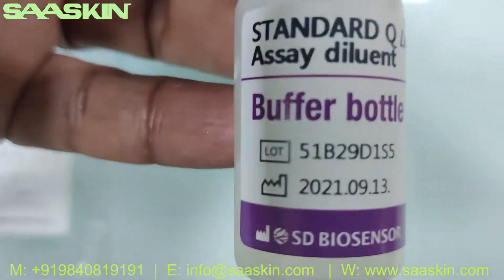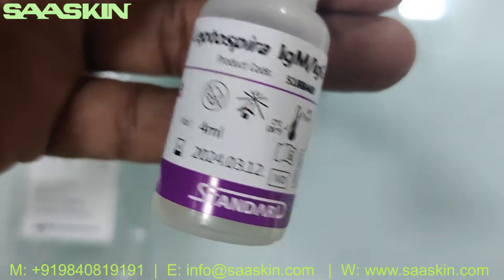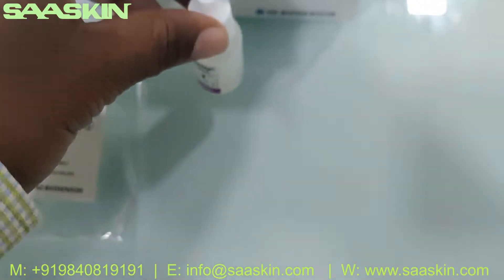Inside, you can see the buffer bottle. This is how the buffer bottle looks like — a 4 ml bottle. There is a buffer bottle.